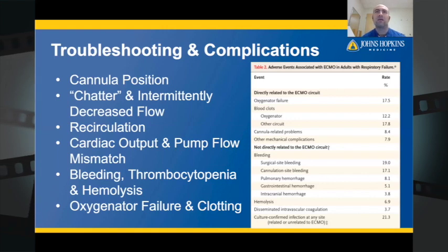And then clotting is one of the most feared complications of patients on ECMO. Often small clot and fibrin deposits will be seen on the lower flow segments or turbulent branch points of the circuit, especially at the oxygenator membrane. Because of this, it is recommended to use anticoagulation to reduce the activation of the coagulation cascade when the blood comes into contact with the circuit.